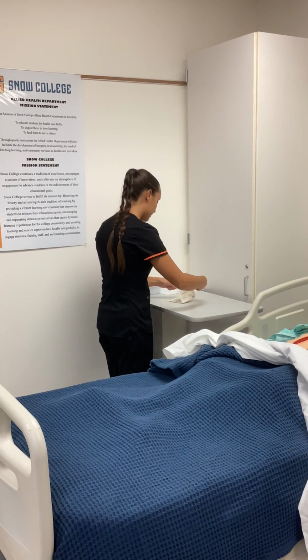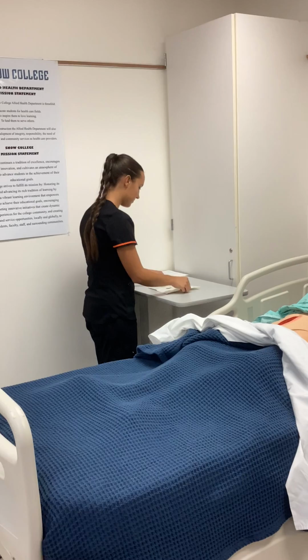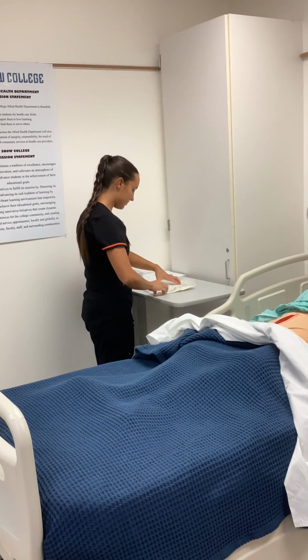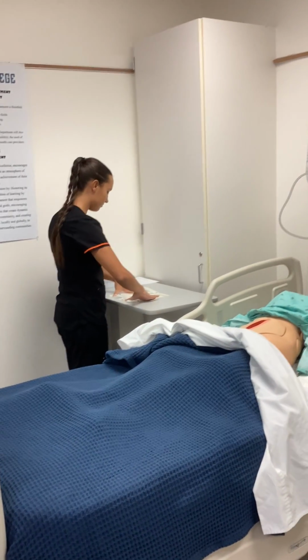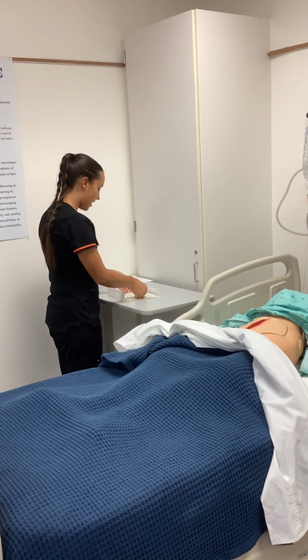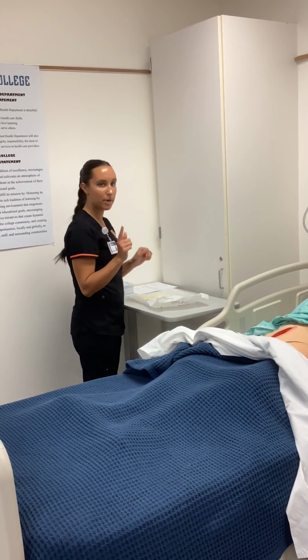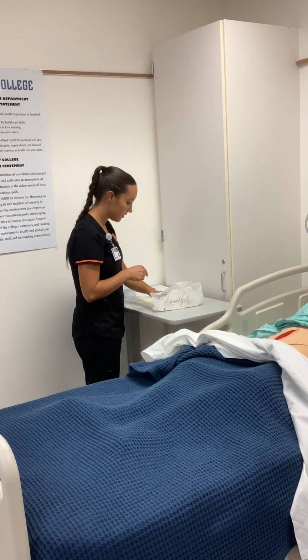And I'm going to open these up. And I just want to make sure that I keep this so that it stays open. And I'm going to open this up. Okay, I'm going to put my right glove on first.